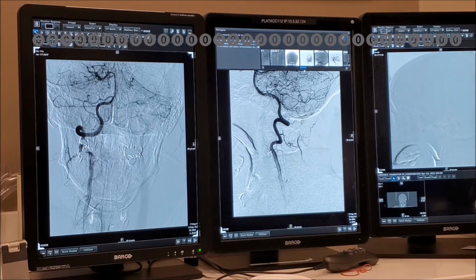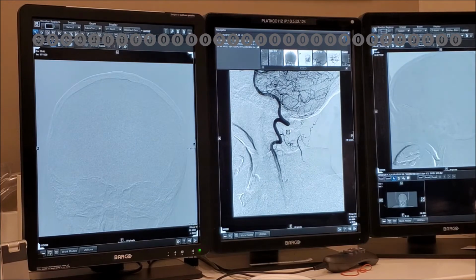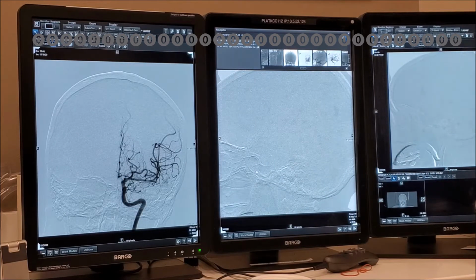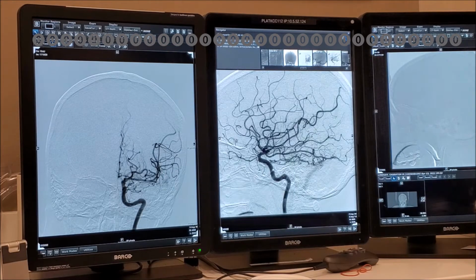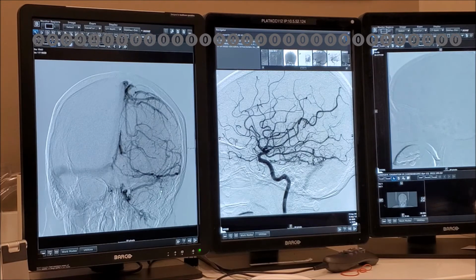So next you went to see the opposite side. Okay. Now we saw the sinus on the right carotid injection. So here, in addition to looking for the fistula, we want to see if we can see. Okay. So the brain is draining through the dominant right side. So we need to reconstruct what happened, if this is thrombosed or developed. We'll get to that in a second.